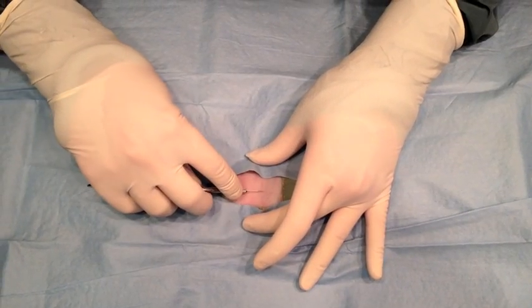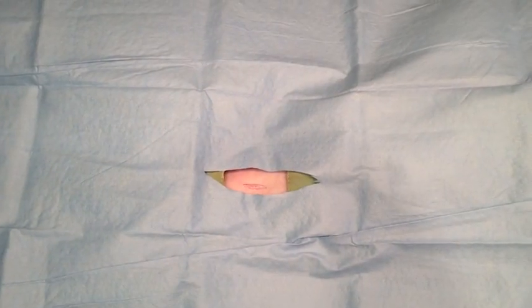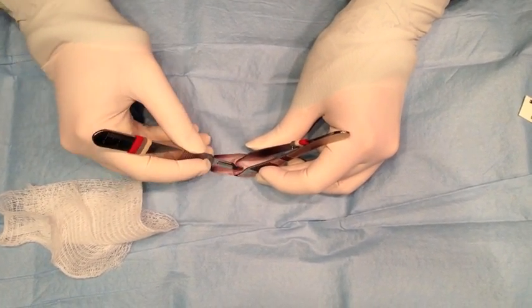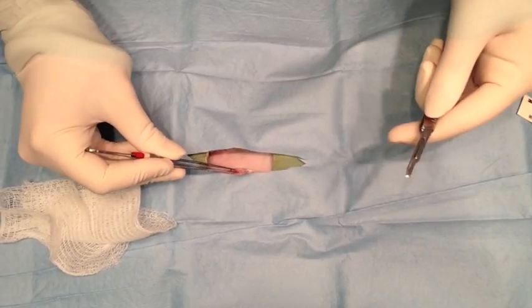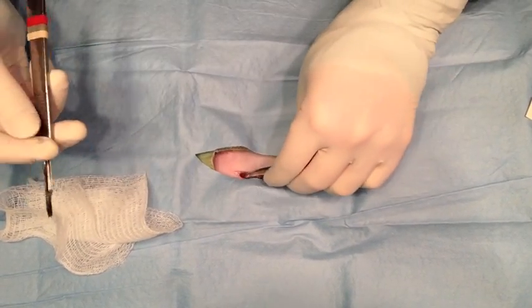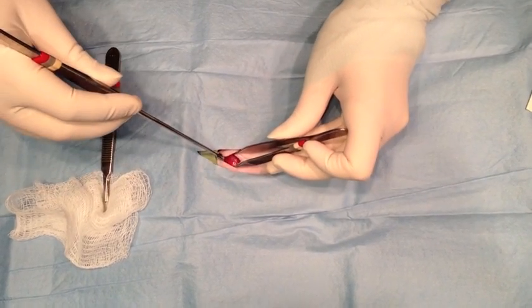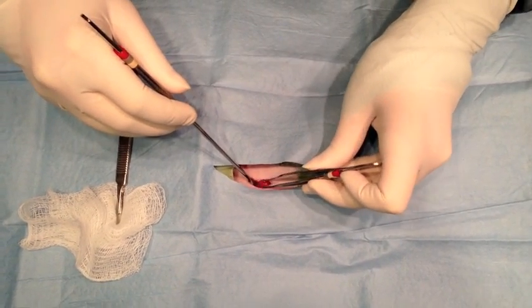Here we have the beginning — the rabbit has been draped and I'm cutting the incision. I'm not hacking at it, just trying to get through the skin. Rabbit skin is actually really delicate and easy to cut, so the prepper has to be careful. Here I'm getting some of the fascia out of the way, poking a hole through the linea into the peritoneum, and extending my incision so I can look for the uterus. I'll take a spay hook — the uterus in the rabbit is right at the top, right at your incision, really pretty easy to find.